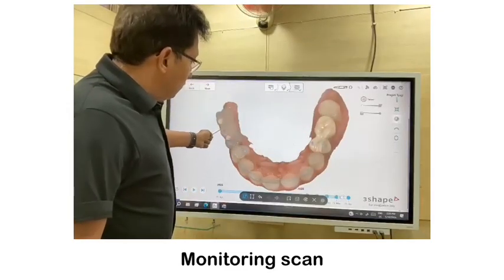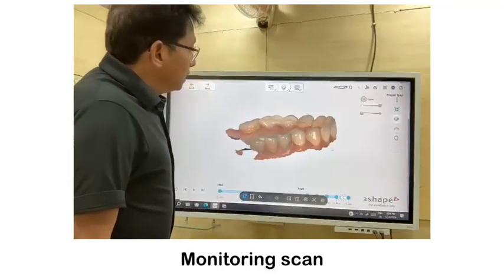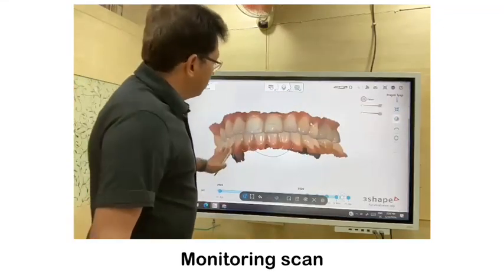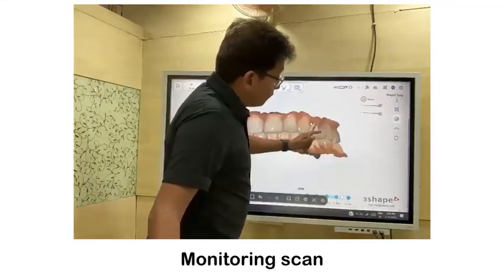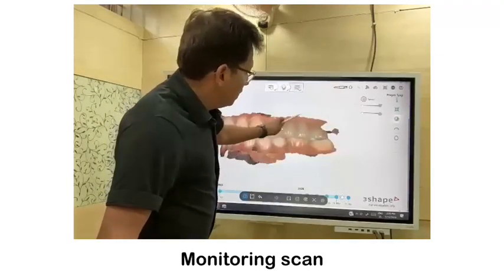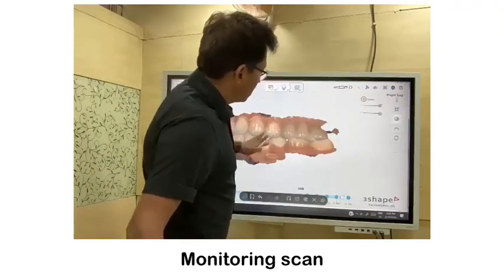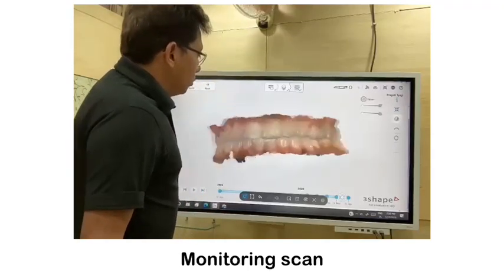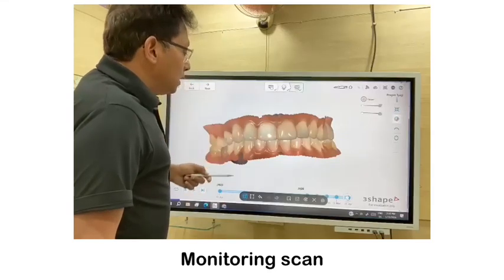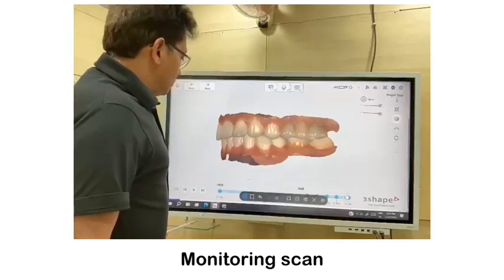And when we balanced the occlusion, we initially placed PMMA crowns for 6 to 8 months. Then we switch over to zirconia crowns. So this patient is in the final stages. We have placed zirconia crowns directly only for implants, not for others. So wherever there is an implant like here and the implant here, these PMMA crowns are to be kept for 6 months. Once the bite is adjusted, equilibration is done in phases every 2 months, and once the occlusion is established and stabilized, we switch from PMMA to zirconia, layered or monolith depending upon the opposing tooth, or Emax, whichever is required.